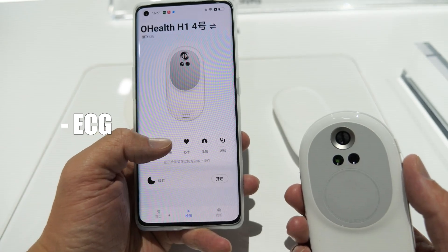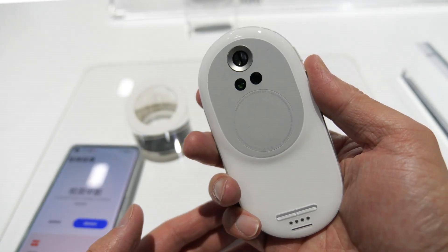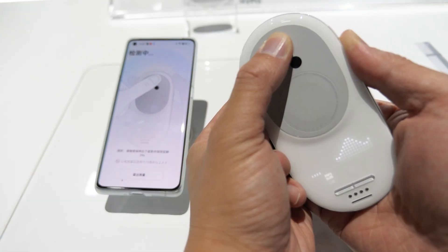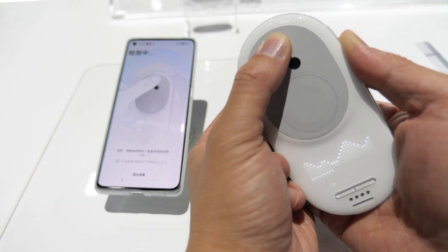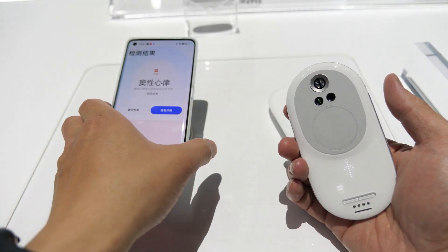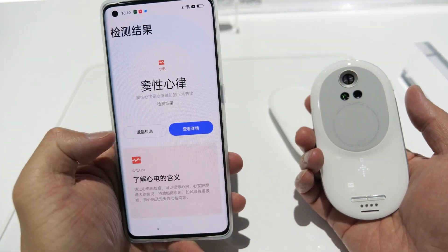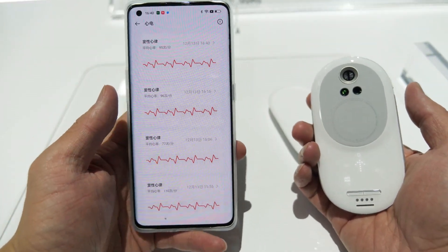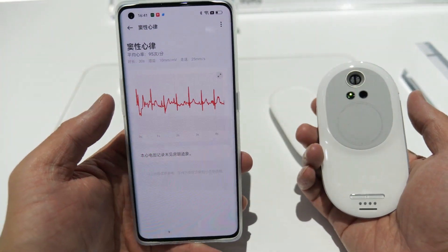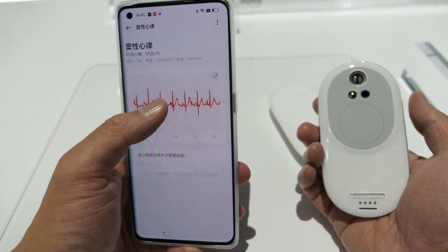The second is ECG. You have to measure in this way — one hand holds it and one thumb put there. Keep it for 30 seconds. Okay, it will generate a report. This is the detailed one, like it shows everything — your average heartbeat and all the history.